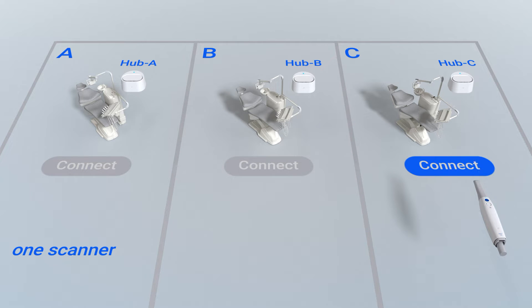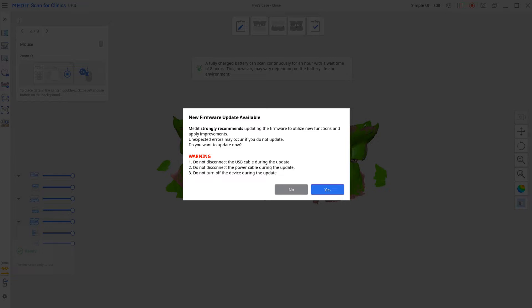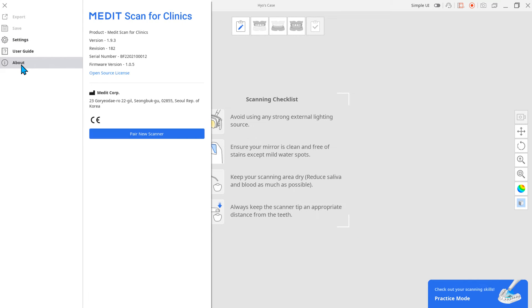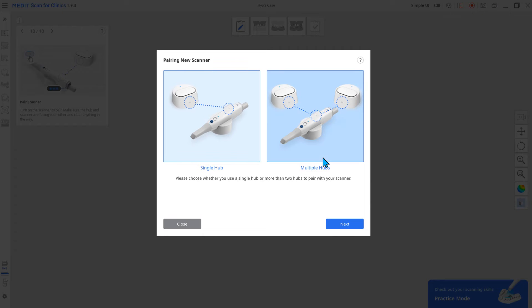Let's take a look at how to use switch and scan. Before using the switch and scan feature, make sure your firmware is up to date. If you connect to a new hub that has never been connected to your scanner, you must manually pair the scanner to the new hub.